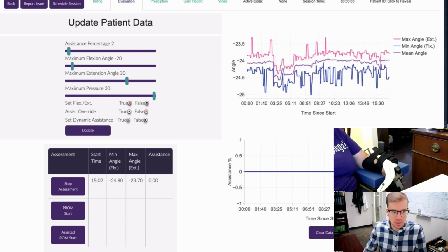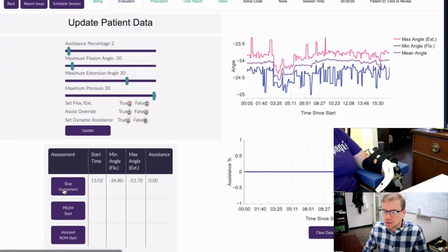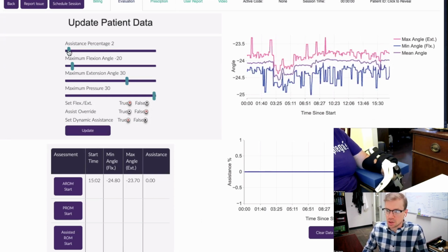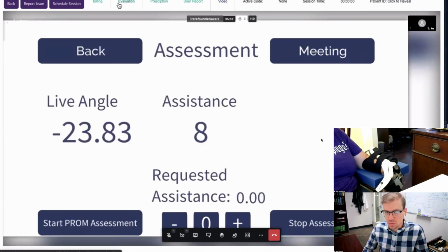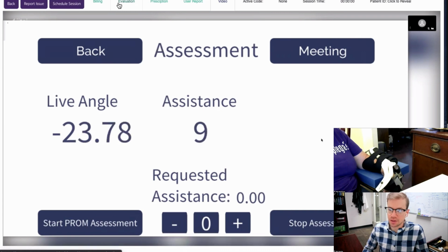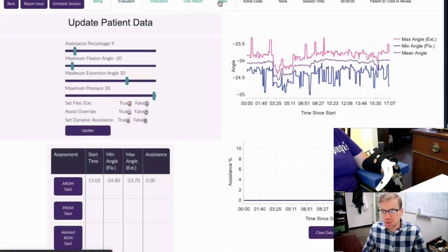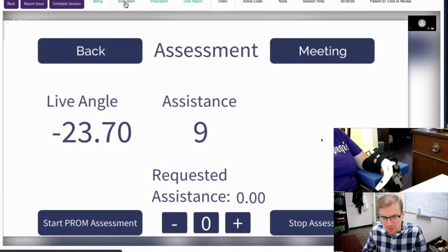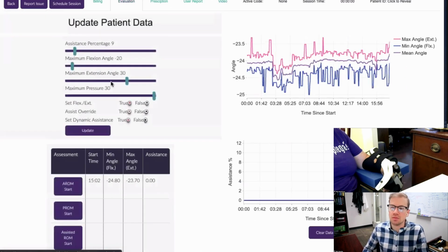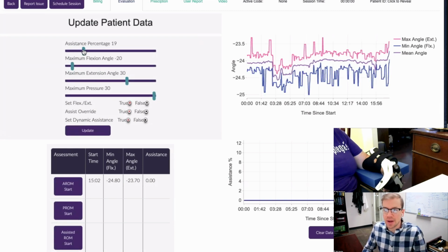Let's go ahead and do our next step here. We'll do our passive check. So go ahead and relax. I'm going to do a couple of modifications here. There's going to be some assistance coming into your Motus hand. You may feel it start to move a little bit. Now, I'm going to have you go ahead and relax as much as you can and close your eyes. I understand you said you might have some difficulty with this process, but I would like you to tell me as soon as you feel the Motus hand move you for the very first time. And don't rely on the sound, because the sound will give it away. Just do your best to feel what's happening in your hand.